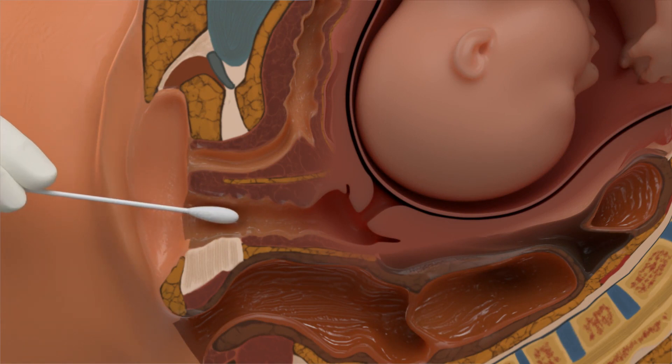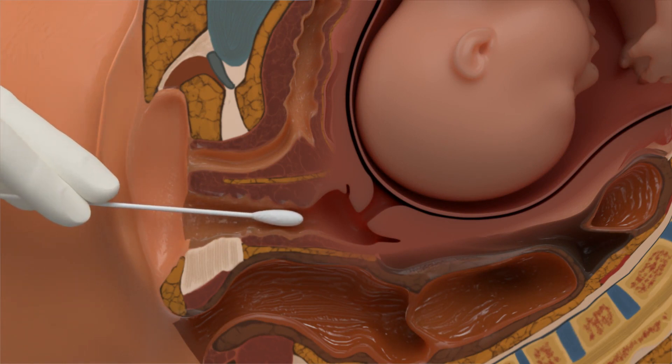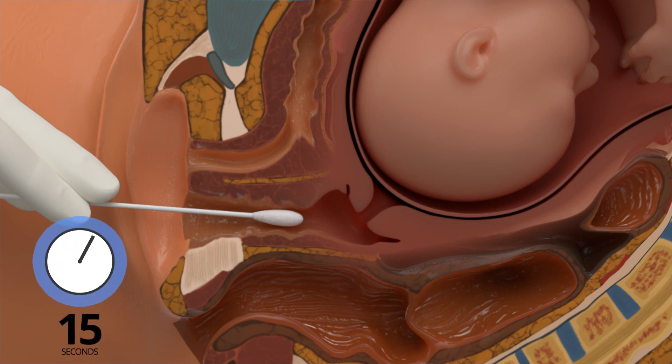Remove and insert the swab tip into the vaginal vault 2-3 inches or 5-7 cm. Hold the swab halfway down the stick to ensure proper placement.